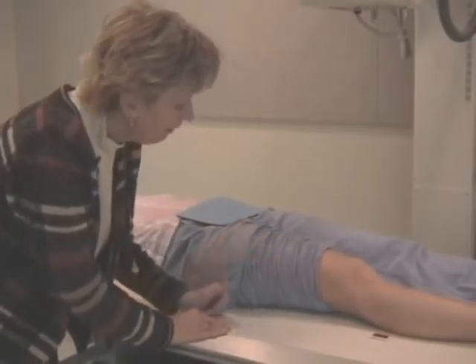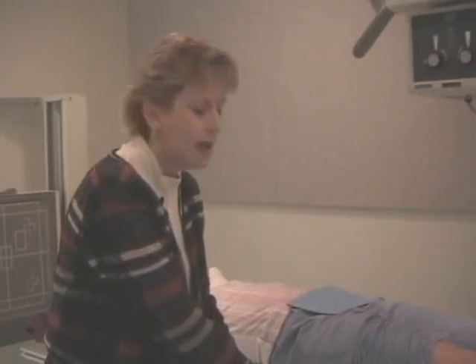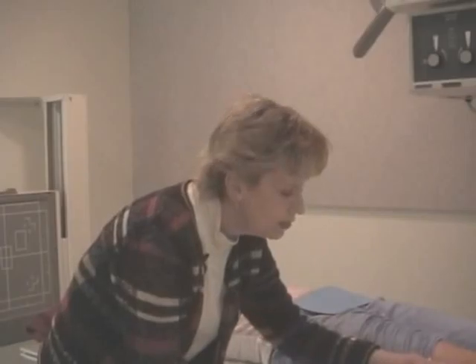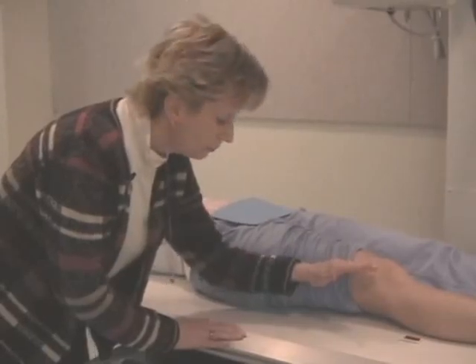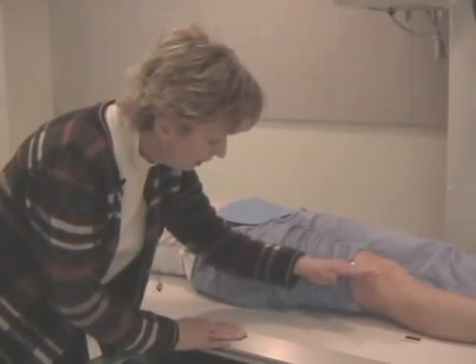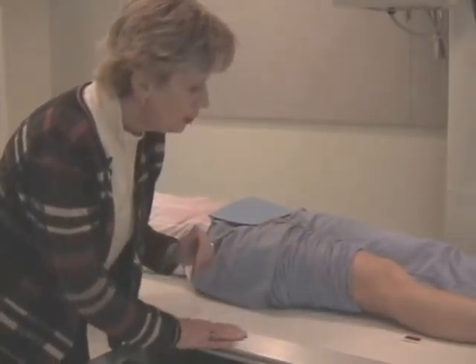Okay? You're going to have to analyze the patient's leg, and you will have 3 options. A caudal tube angle of 5 to 7 degrees, or the tube may be perpendicular, or you may be angling cephalic 5 to 7 degrees. And I hope I've explained this well. If the femur is parallel or angled a little bit this way, it would be a caudal tube angle. Perpendicular beam, and a cephalic tube angle. So let's do our demonstration now.